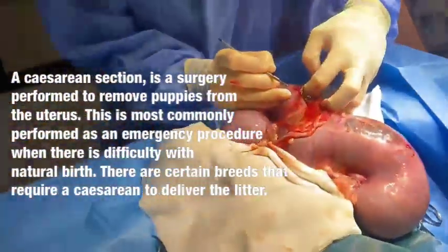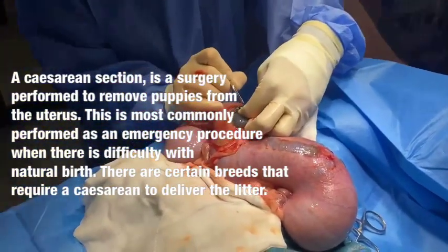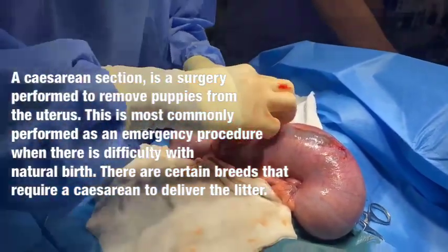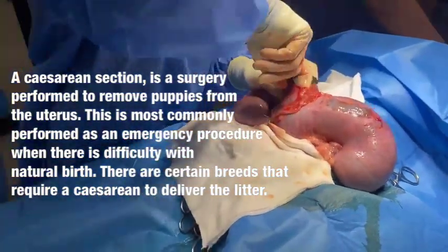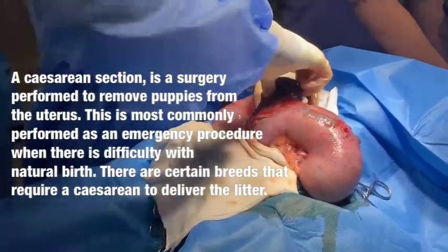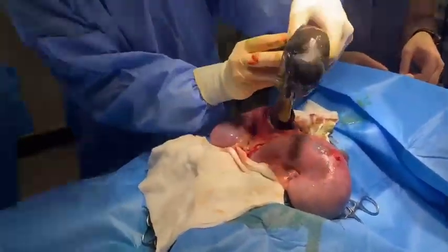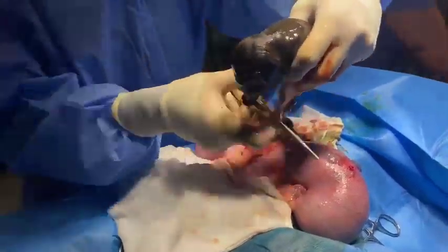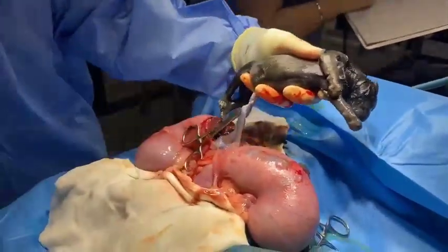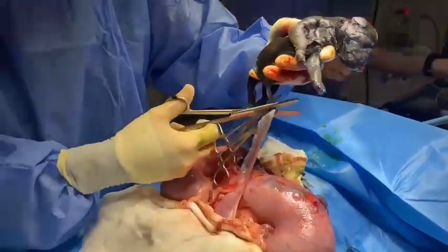We're making an incision through the uterine wall to get our first puppy out. This is part of the placenta just there. We clamp the umbilical cord, and the puppy is out.